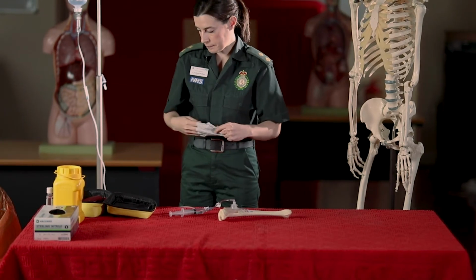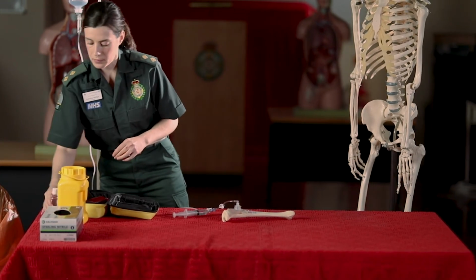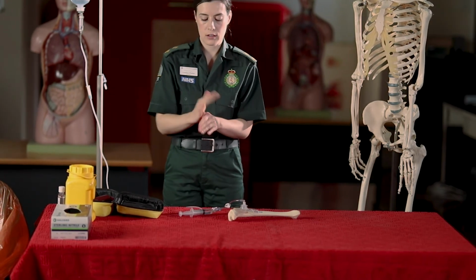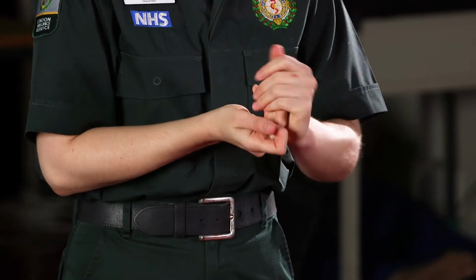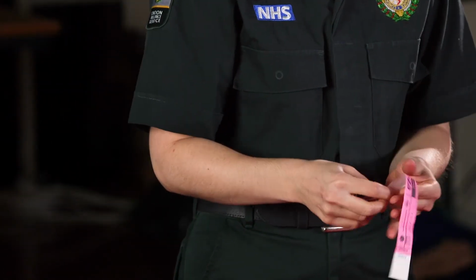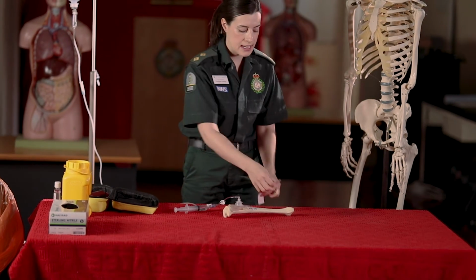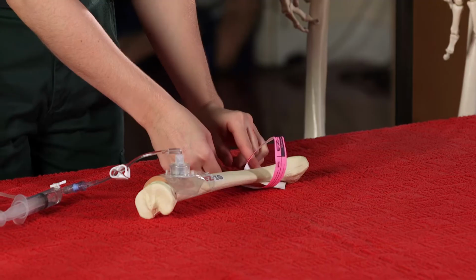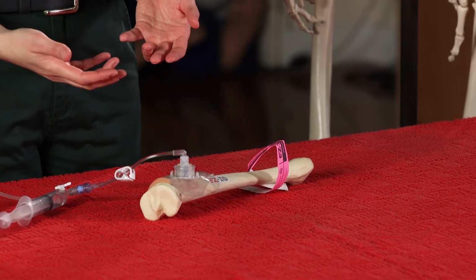Remove my gloves, clean my hands, and document the time and date on the wristband and attach it to the patient. And then complete my PRF.